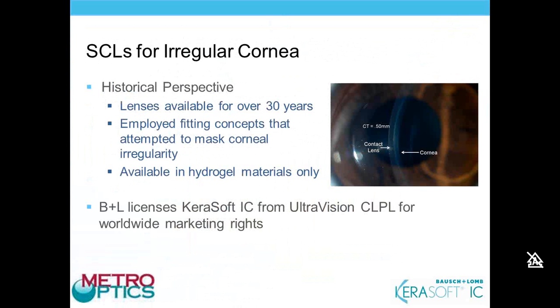And some of these lenses are also really only available in hydrogel materials. So with the low Dk of the materials and the increasing center thickness, we really are reducing the maximum amount of oxygen that's reaching the irregular cornea that we're trying to fit.